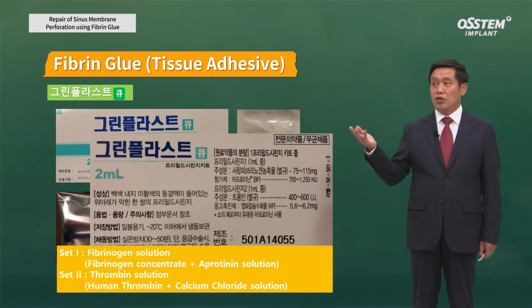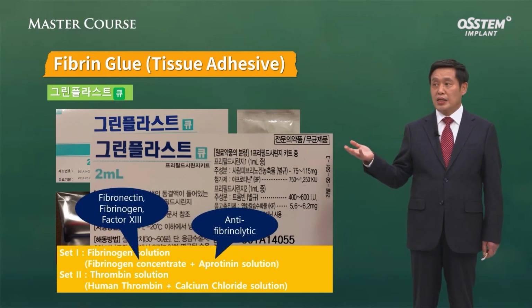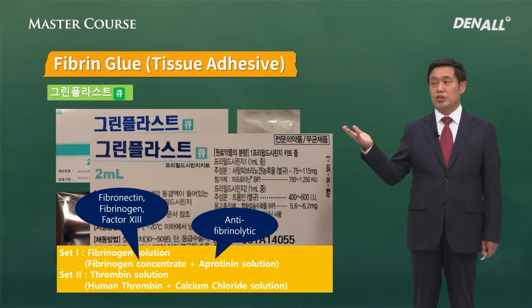If you look at the component, there's a fibrinogen solution and thrombin solution. In fibrinogen solution, there is a fibrinogen concentrate and aprotinin solution. Aprotinin has anti-fibrinolytic property, which prevents a rapid disintegration of the mass.